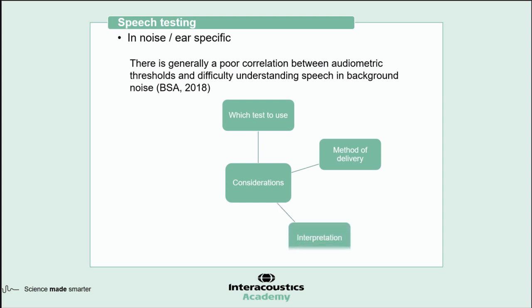The interpretation can also vary depending on what you're trying to establish. It might be that you're looking for a threshold. It might be that you're looking for speech discrimination. It might be that you're just looking for detection, understanding. There's a whole range of complexities that we can investigate with speech testing. And again, I think the clinical question needs to drive that on an individual case basis.